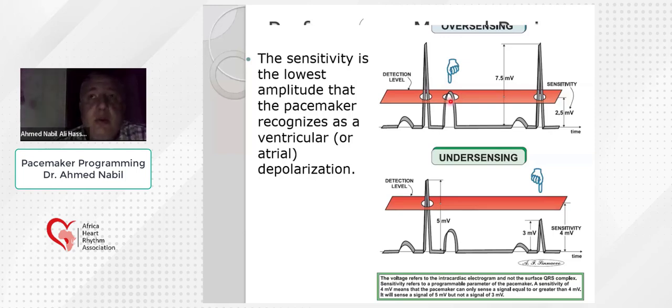For example, the automatic mode switch, because of abnormal heart rate detection. If this is an atrial lead, it can incorrectly diagnose atrial arrhythmia and can cause automatic mode switch.